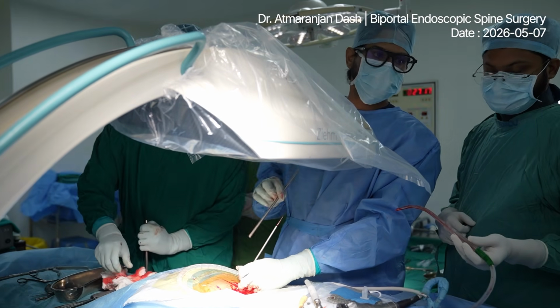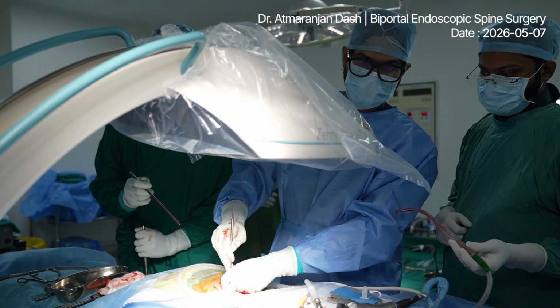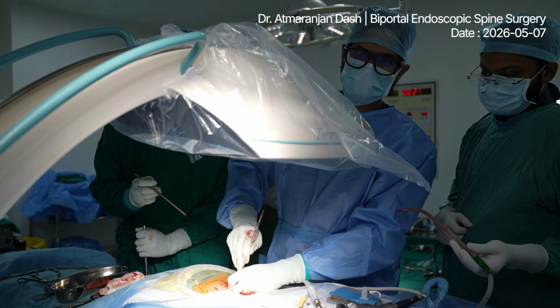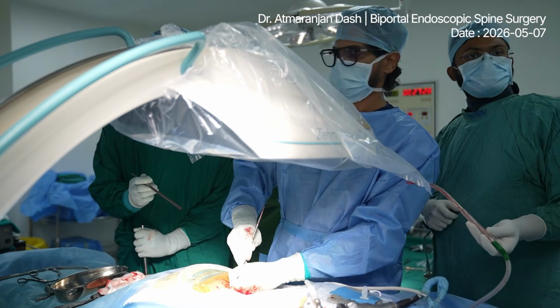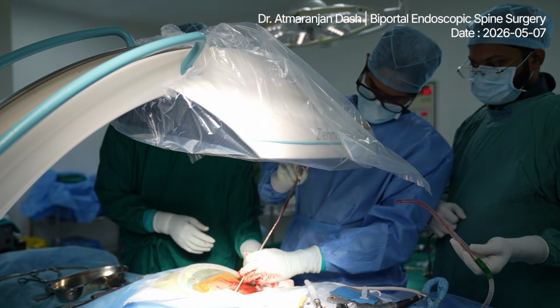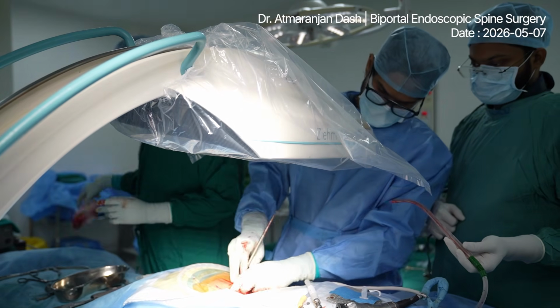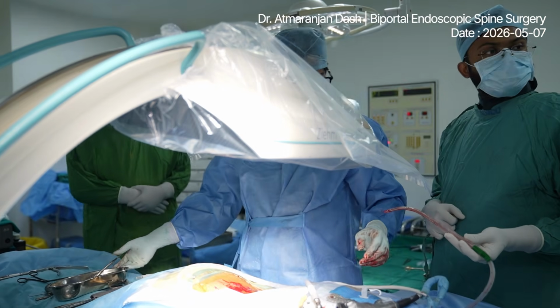The same way we have been doing, we landed on the TP of the L5 and scraped and made a position for the TP landing.